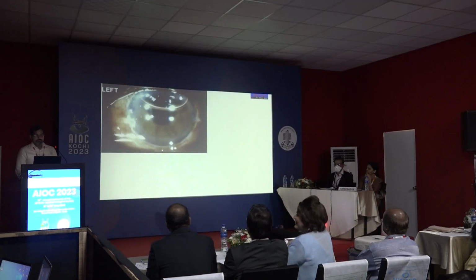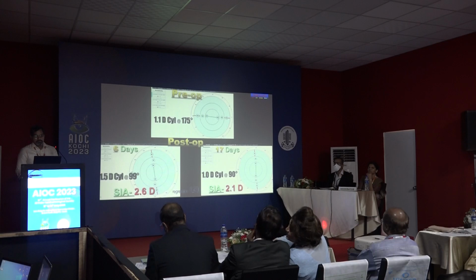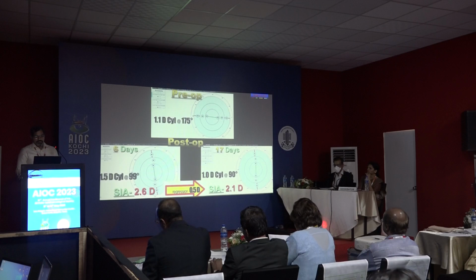These are post-op day 1 and day 6 pictures. Post-op day 6 SIA was 2.6 diopter and 2.1 diopter on day 17, which demonstrates a regression of 0.5 diopter.